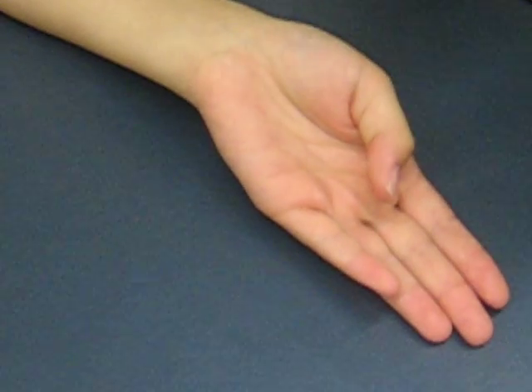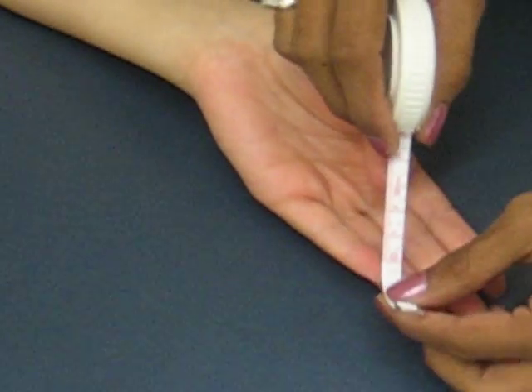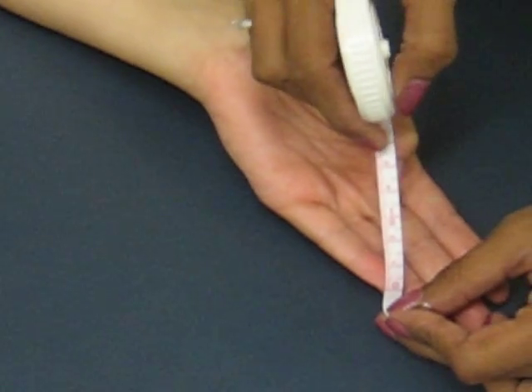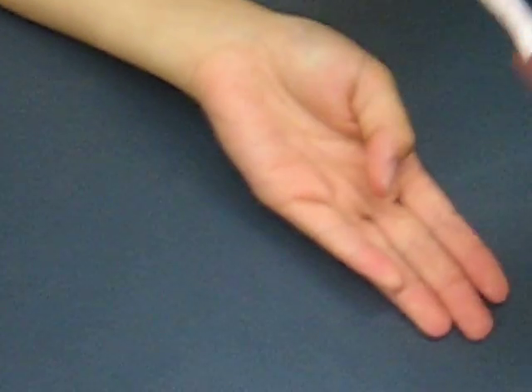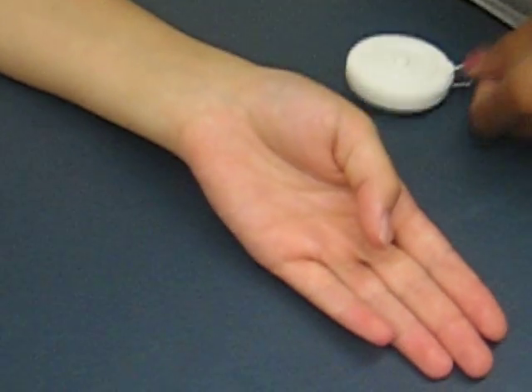I would then measure the distance from the tip of the pinky to the tip of the thumb, which in this case would be four inches. And that's how you would record it.